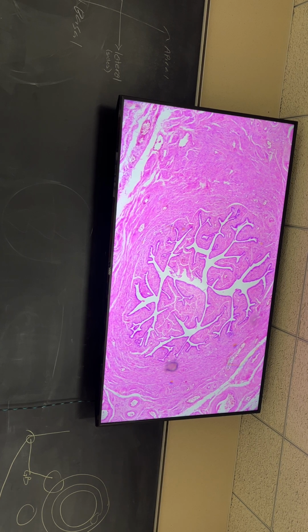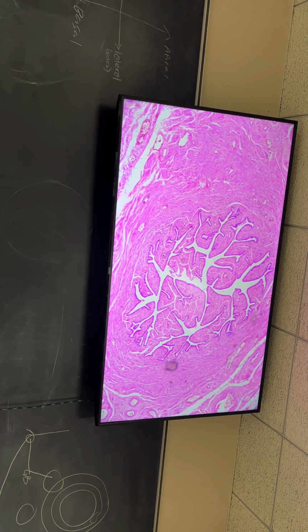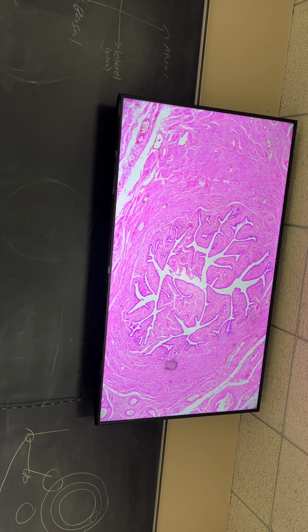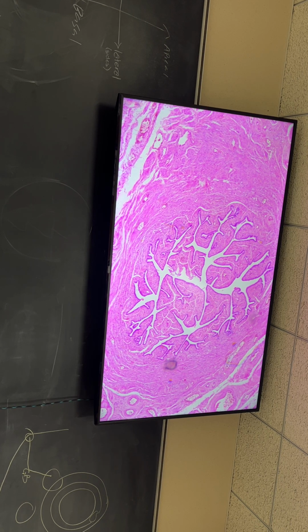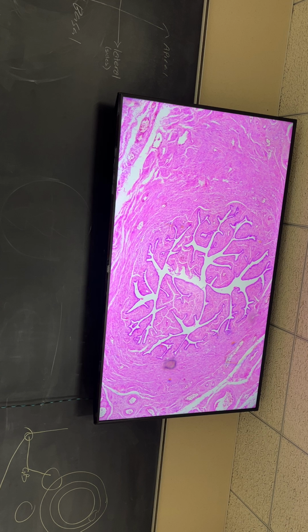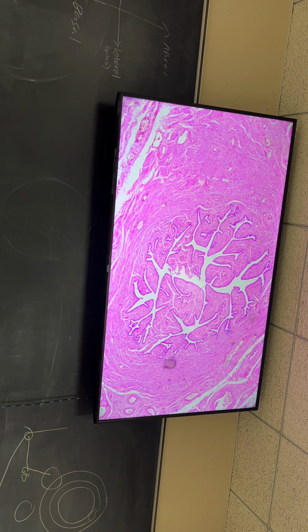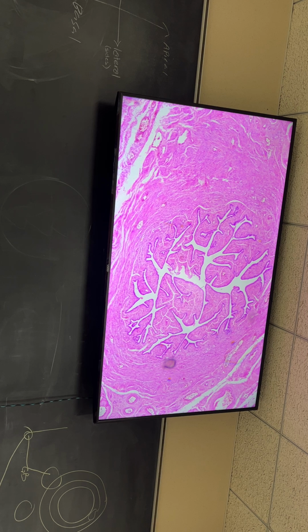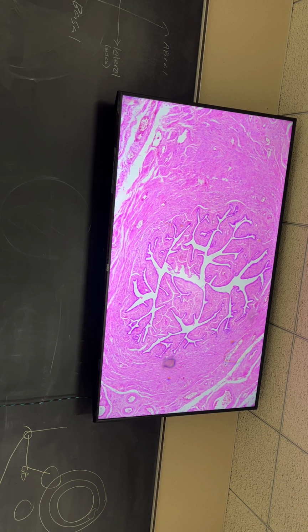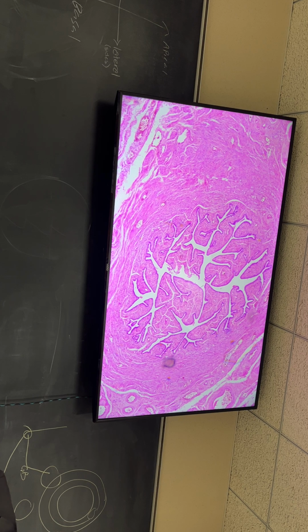So this is your standard tube arrangement. The body has a standard arrangement of the tube, right? Mucosa, submucosa, all that stuff. So you have those same tubes here, those same layers, right? You have the mucosal layer, the lamina propria layer, the muscularis layers, all that is here. The problem is that it's embedded in other tissue and the edges of it are not clearly defined. So start at the middle, work our way out, right?